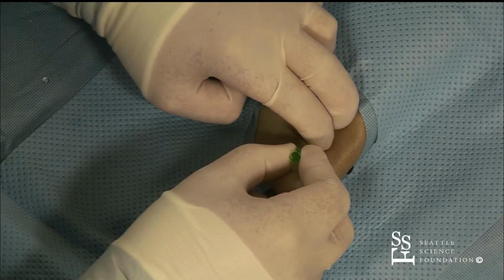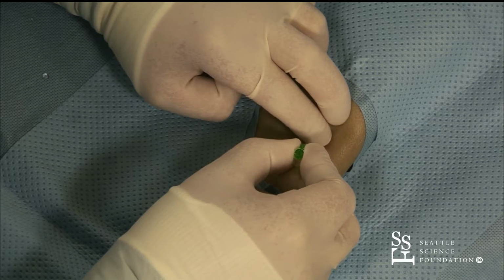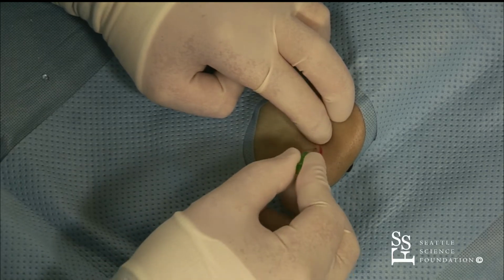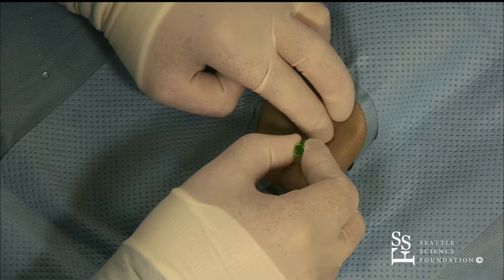You are in a very small vessel with a lumen of 2 millimeters. So the shorter needle is a lot easier to control. Yeah, the long micropuncture is about this long, and the resistance to backflow means it just drips. It doesn't really squirt.